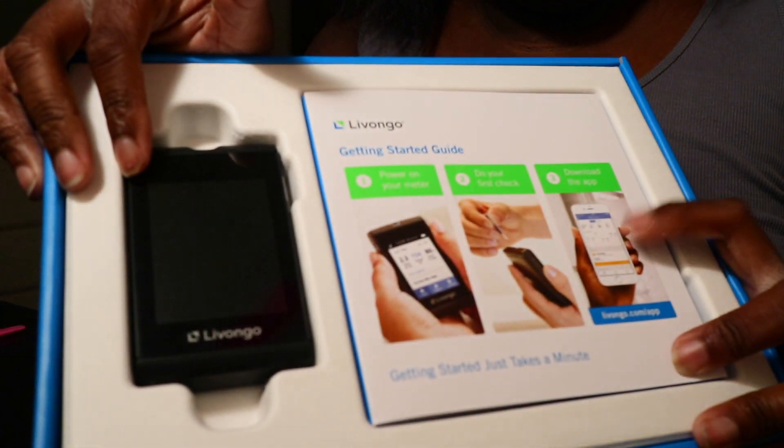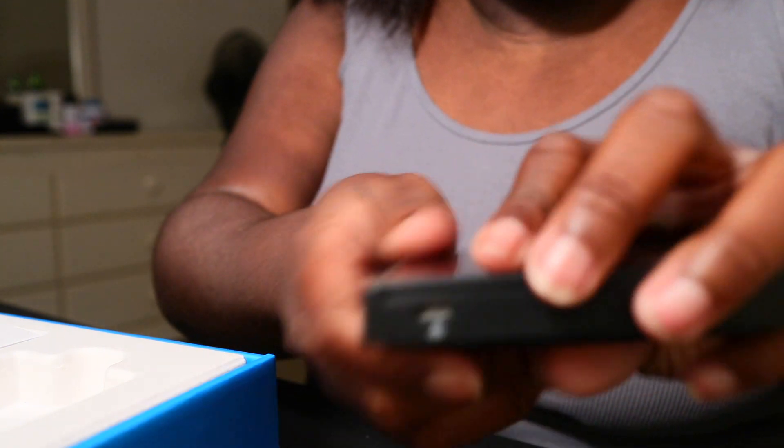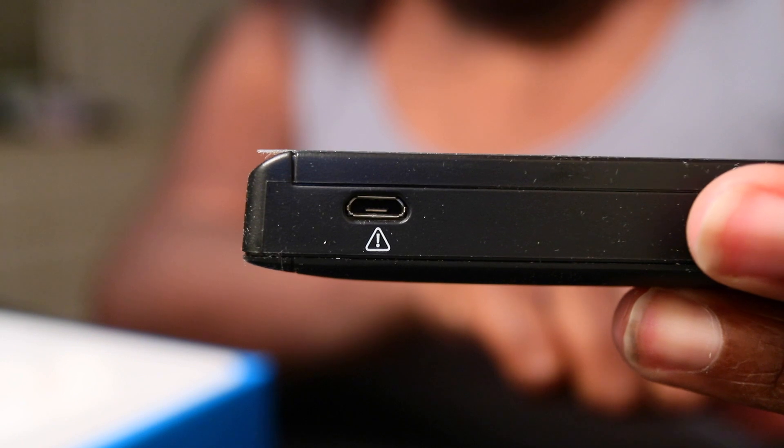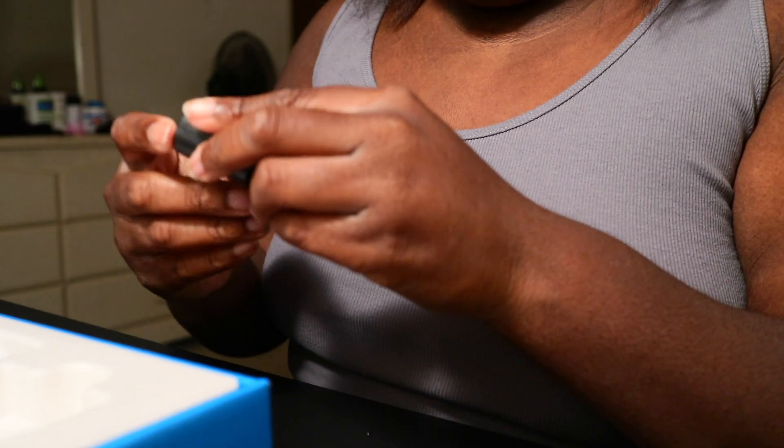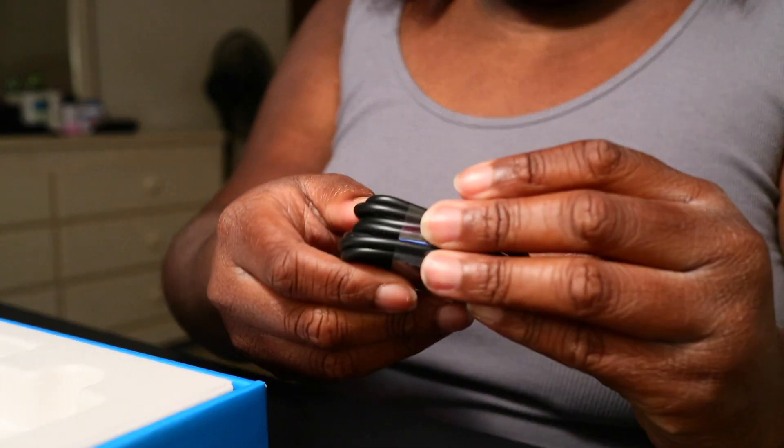Alright, there we go. On top you have your meter, and everything else shows you how to set it up. The meter is kind of a little hefty, and you have to charge it — it charges with a micro USB. There's a get-started guide, it's a booklet, and a user manual in two different languages. It talks about what's in the box. First off, it comes with the USB wall charger and your micro USB cable.